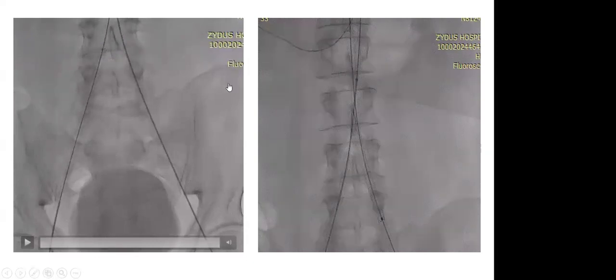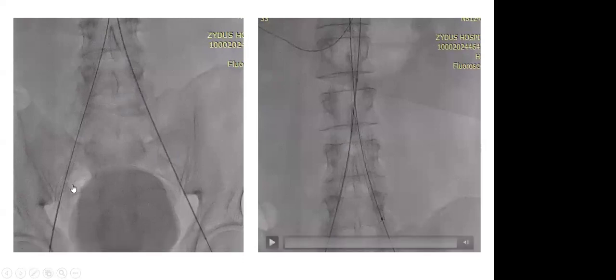In other aortoiliac cases that we have done, I used to do bifurcation Y stenting, that is a 14 mm stent inside the aorta and 2 7 mm stents in the common iliac artery. But here I was not sure whether I should cross again after putting the 14 mm stent. And the landing is slightly longer, because even then 3 stents would not be able to finish it, so I would have to put 5 stents. So I let go of that idea and I put 2 extended 7 mm stents. Here it's a 14 mm. So this is the proximal stenting.